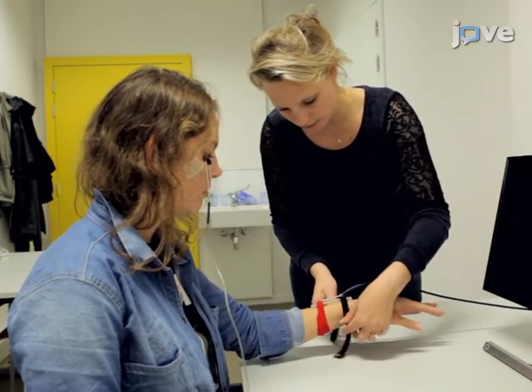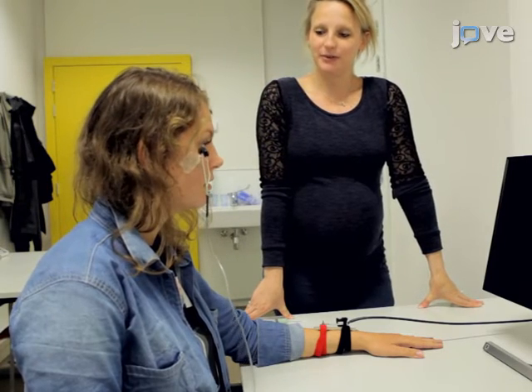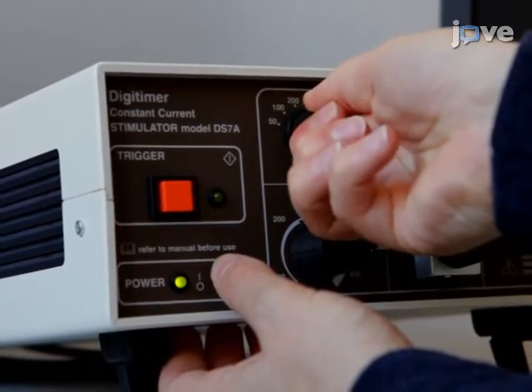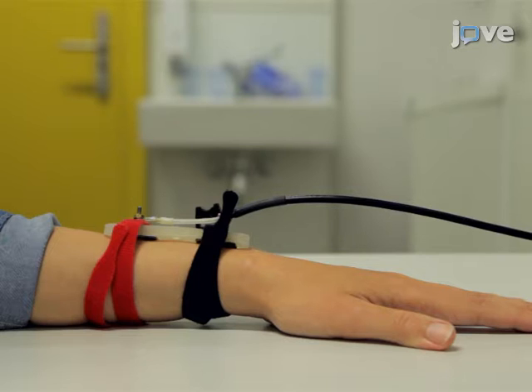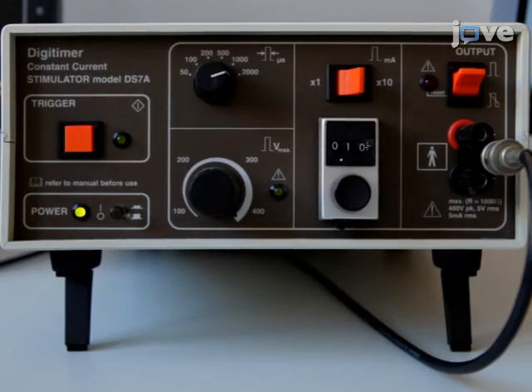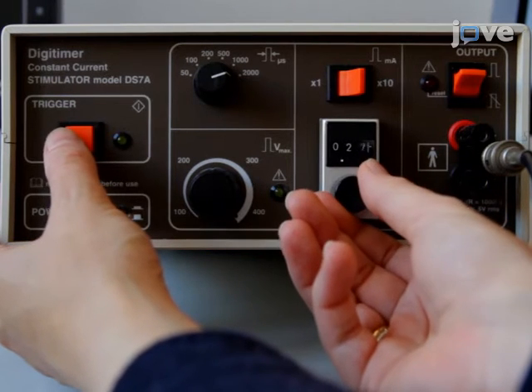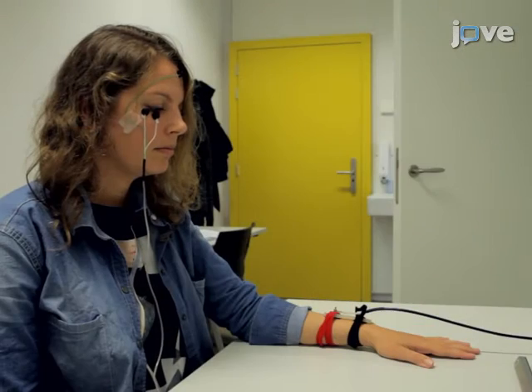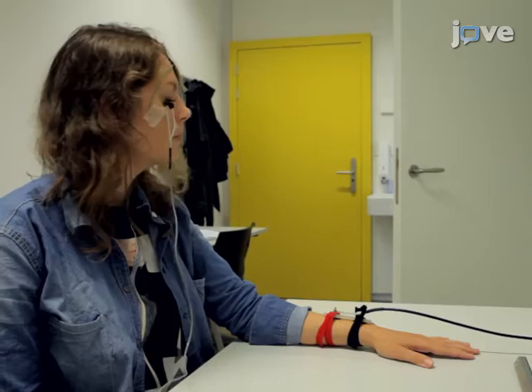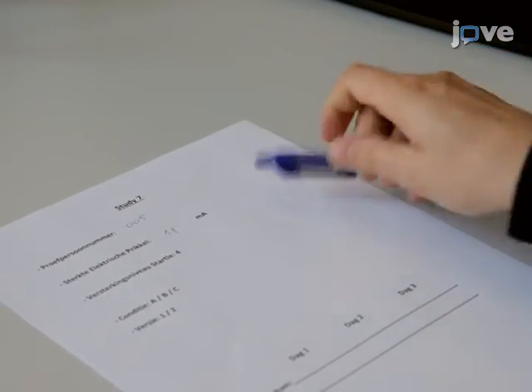Make sure the strap is not too tight. Inform the participant that the shock should be uncomfortable but not painful. Adjust the intensity of the 2 ms electric shock for each participant individually. When ready, manually trigger the shocks. Start at an intensity of 1 mA. Continue triggering single shocks while gradually increasing the intensity in 2 or 3 mA increments. Stop when the participant reports that the shock is uncomfortable but not painful. Write down the final shock level and maintain this level throughout the remainder of the experiment.